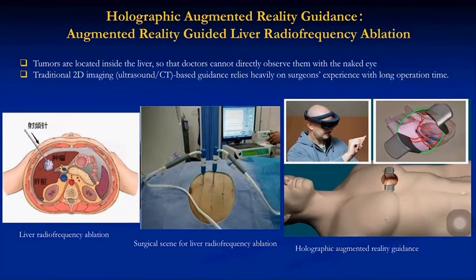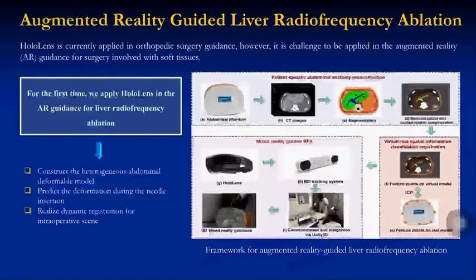So in typical radiofrequency operations, the needle has to be inserted into the tumor, and then the high temperature generated from the tip of the needle will destroy the cancer cells through this treatment. So here in this project, we use HoloLens in the AR-guided liver radiofrequency ablations.